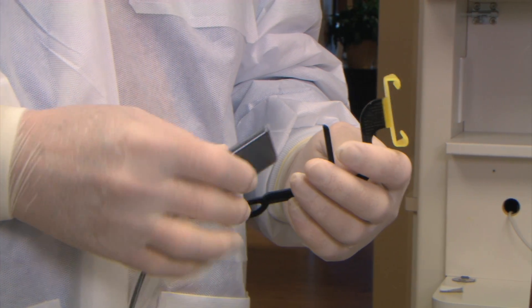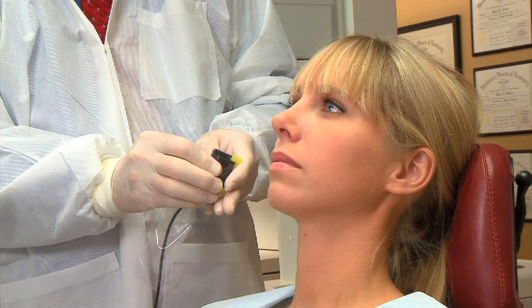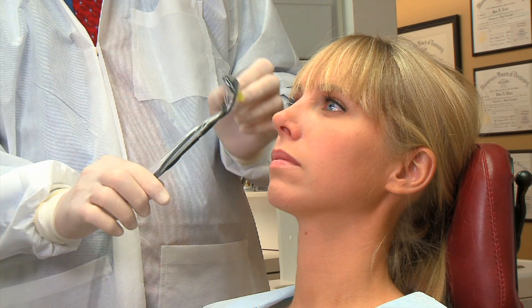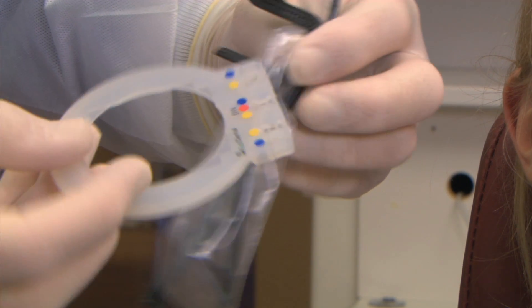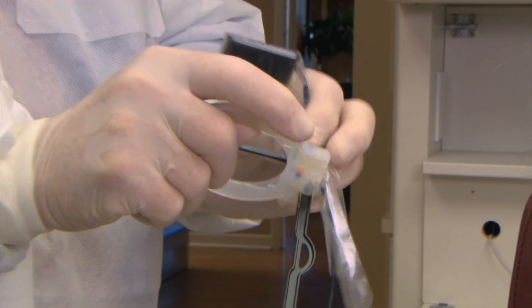For the posterior PAs, use the Trollbyte Chimera Yellow. Push the sensor halfway into the claw so you use the full image area of the sensor. Keep the cable along the arm of the holder. On the aiming ring, the yellow dots indicate the positions for the posterior PAs, both upper and lower. Snap it in place and you're ready to take the maxillary PAs.